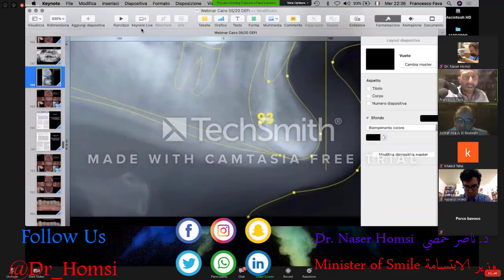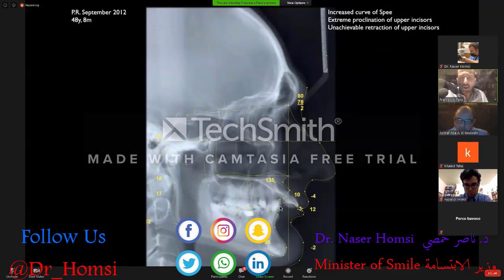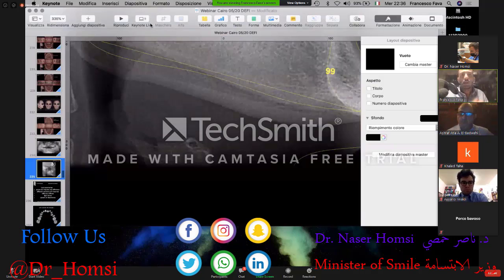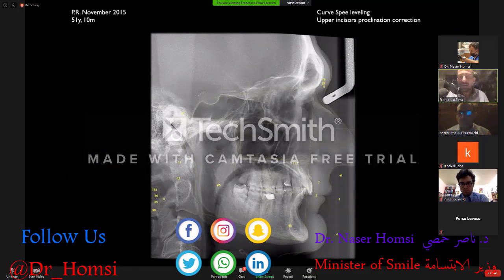I want to share one last picture. This is the initial position of the beginning of the incisor. I considered as acceptable a slight proclination that could help me in leveling the lower arch, but the question is very good. Okay, thank you.